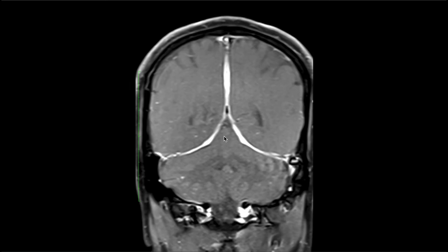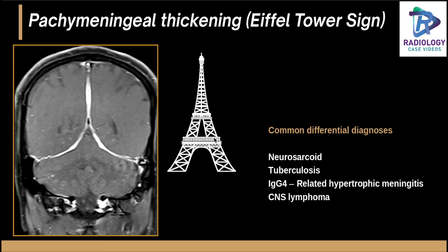This is a classical case of patchy pachymeningeal thickening — the Eiffel Tower sign. Whenever you see such diffuse pachymeningeal thickening, you should always think of neurosarcoidosis and tuberculosis (especially in the developing world), IgG4-related hypertrophic meningitis, CNS lymphoma, Behçet syndrome, and Wegener's granulomatosis. Unlike leptomeningeal enhancement, you may not see enhancement within the gyri. This is a classical Eiffel Tower sign due to pachymeningeal thickening.